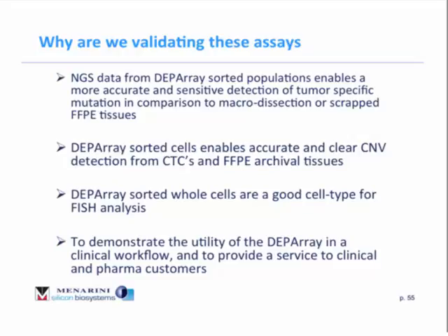Well, really, as I stated in the beginning, when you look at these technologies, when you look at the exquisite sensitivity of an NGS assay, for instance, in most of these cases, the limitation of the sensitivity of the output is a function of the template population that you put in, and this is especially true for FFPE tissues.